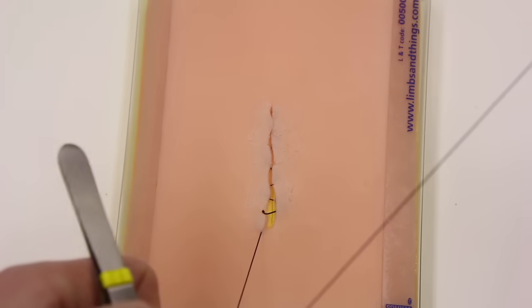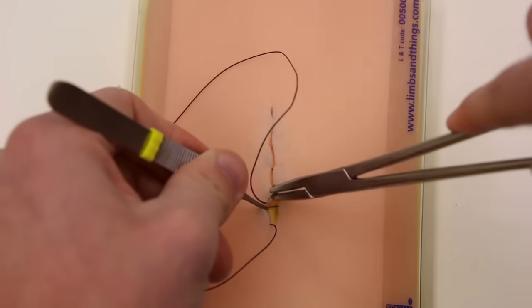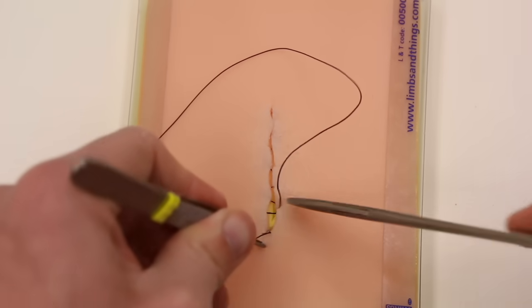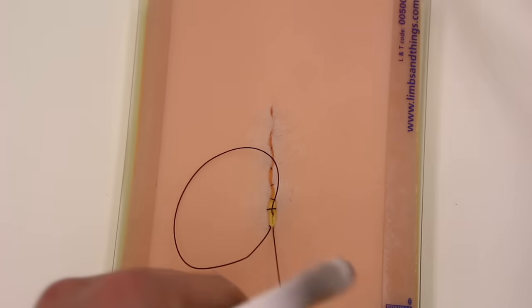And then, going almost all the way through. Now you're going to get another bite of that dermis, much as you did right at the beginning. Again, you're trying to hide a knot.